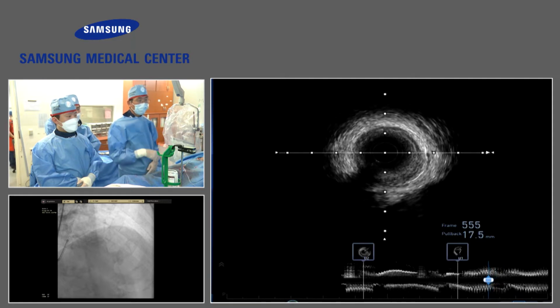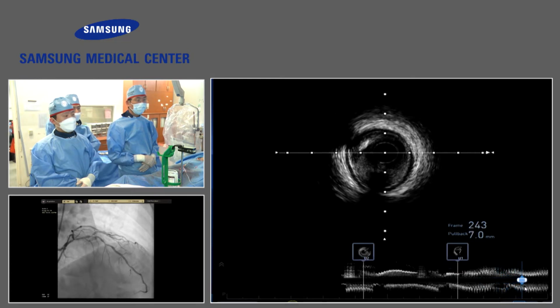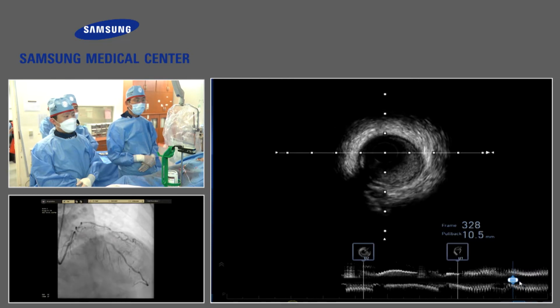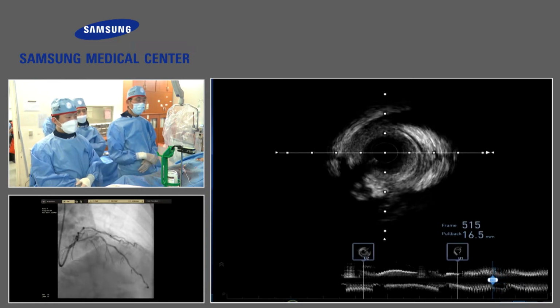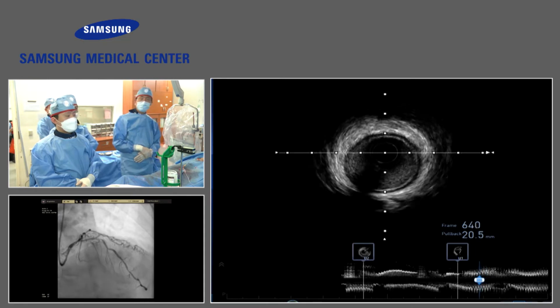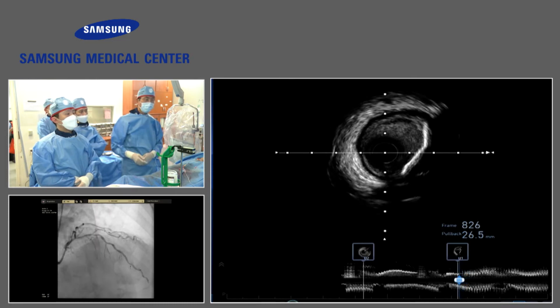You can see, a little further back. Again, a little back. You can see the bridging, then proximal. Yeah, bridging myocardium here. This is a myocardial bridge, from 9 o'clock to 2 o'clock. So this stenosis is not so severe. Initially, I'd like to extend the stent down to this lesion, but I need to skip it.